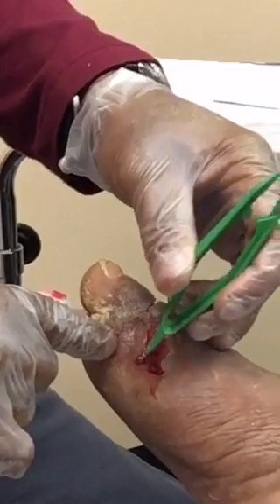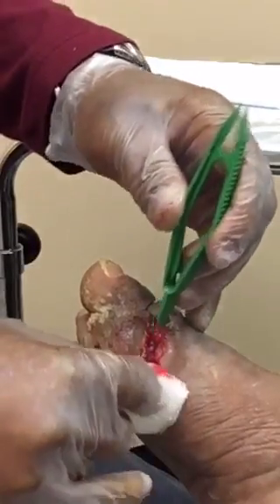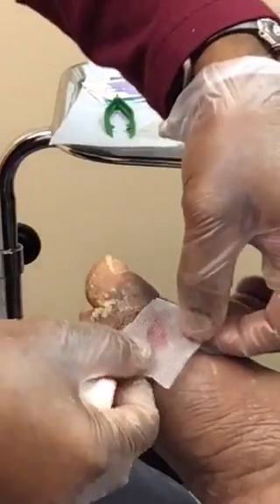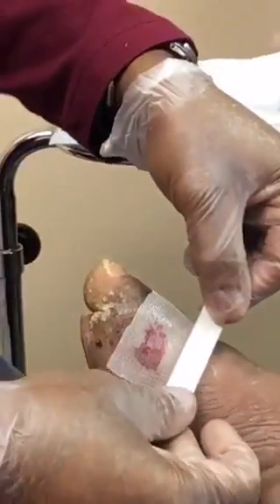What I'd like to do next is put a non-stick gauze directly over the graft. I'm going to use Adaptic Plus in this case, which keeps everything in place. Then I need some tape or Steri-Strips just to hold everything down.